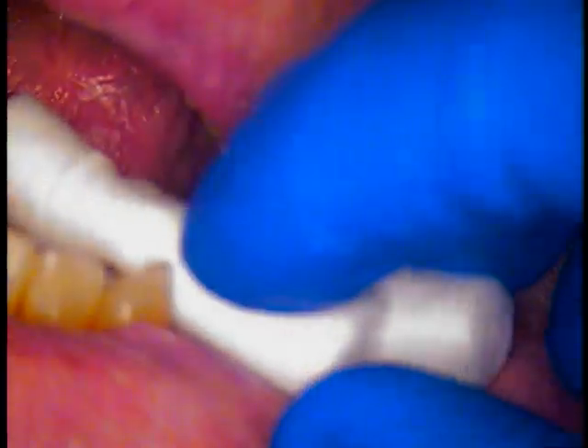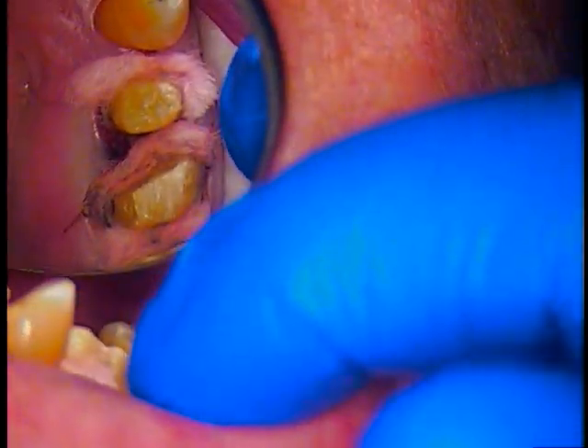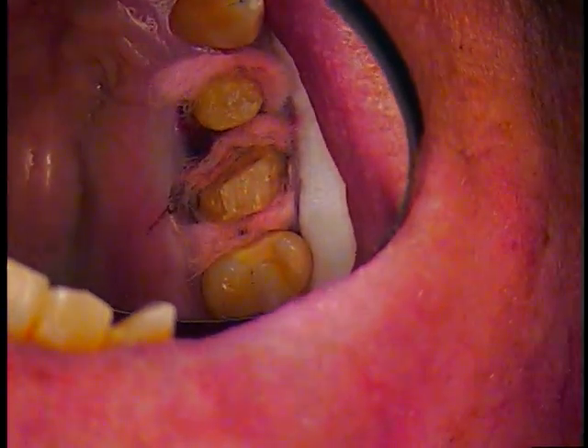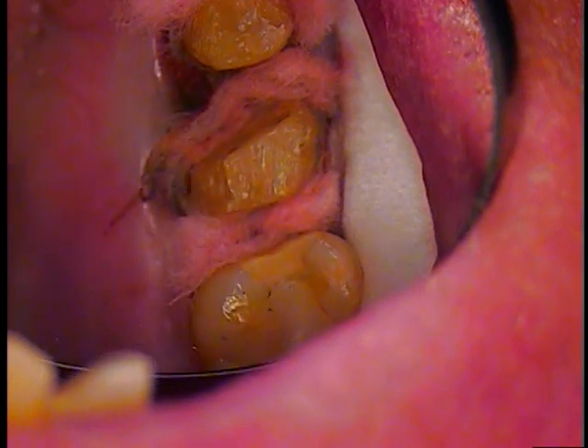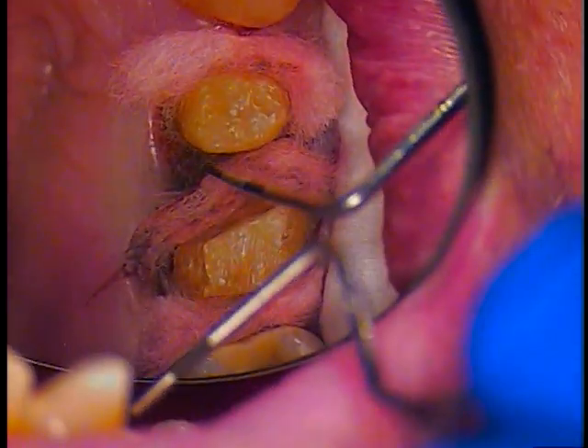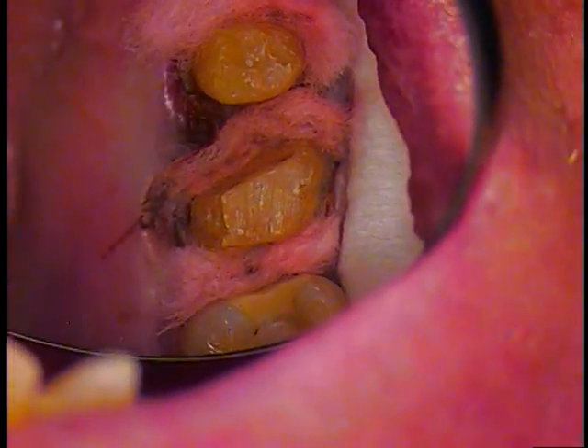Next step, we're going to look in the mouth. Suction on. Large mirror. So what we're doing now is we've been having him sit for about five minutes with pink cotton — that's our ginger pack, a gingival product made to dry up the sulcus itself. You can see there's some redness in this lower left area. See how red that is? We're going to treat that with an astringent material. Everything else looks perfect, but right there I don't like that.